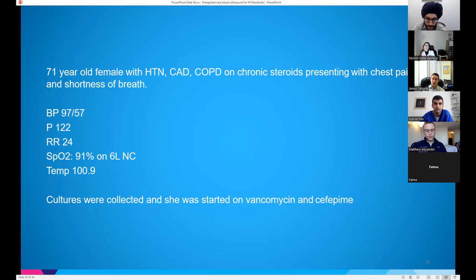And also, you'd be surprised how chest x-rays will be very unimpressive, and then you throw an ultrasound there and you see some dense consolidation. Those of you who are using ultrasound more and more in your clinical practice, you'll start to appreciate that, as I have. So chest x-ray is okay. Ultrasound is much better at looking at the lungs and looking for those dense consolidations. So something like this obviously can happen on many, many occasions. So ultrasound is very important to incorporate.